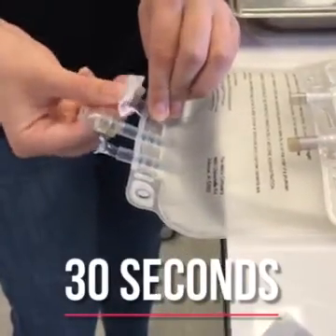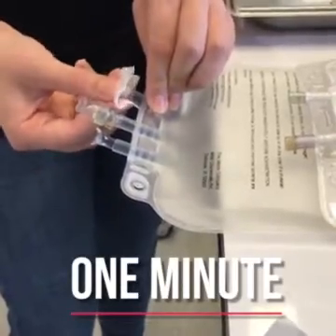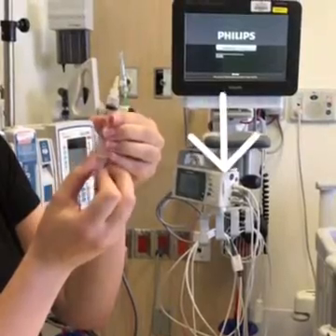Clean the injection port of the PN bag with an alcohol swab for 30 seconds. When finished, this will also need to air dry for one minute. Pull the plunger of the syringe down to the one-milliliter mark.